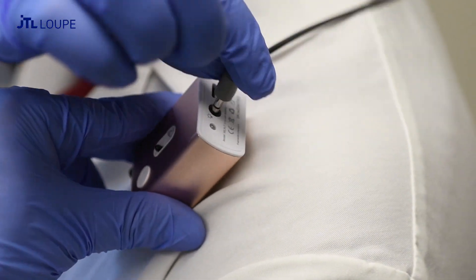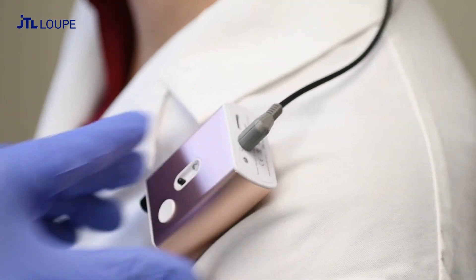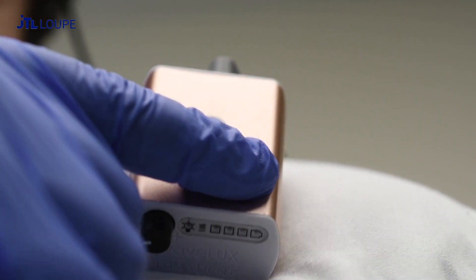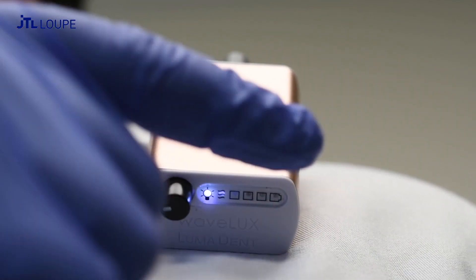Finally, plug the wire into the battery. Pressing the power button will turn the battery on or off. This will also display the charge battery level.